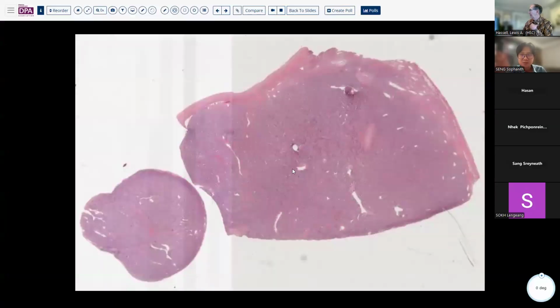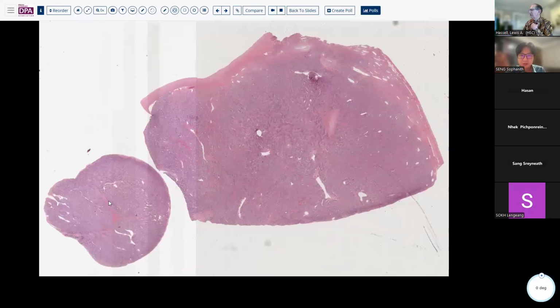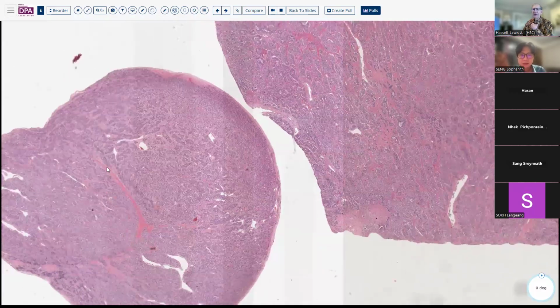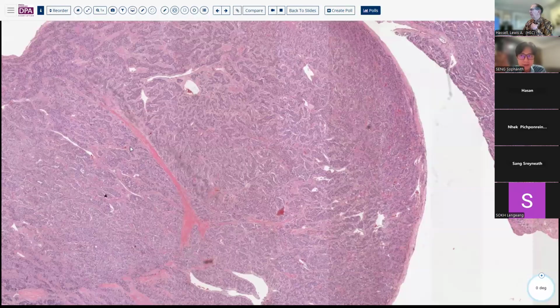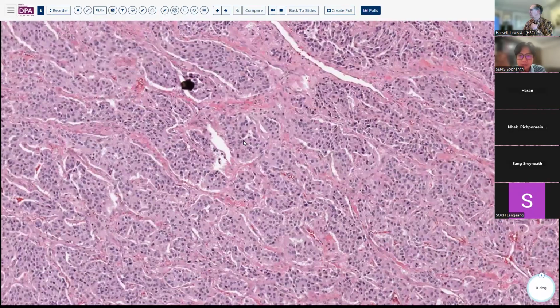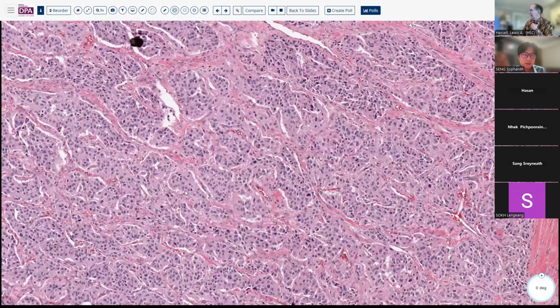All right. Well, no self-respecting surgical pathologist can ignore neuroendocrine tumors, and the mediastinum, of course, has its share. Typically, these are associated with things like the aortic body or the carotid body and so forth, and come in the form of a paraganglioma, which is, in fact, what this case is, but a nice illustration of the packeting of these cells into small nests and packets.